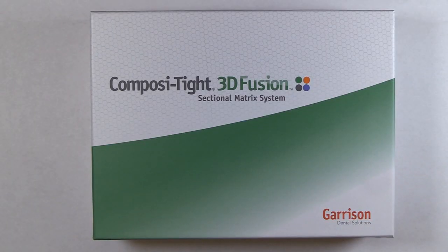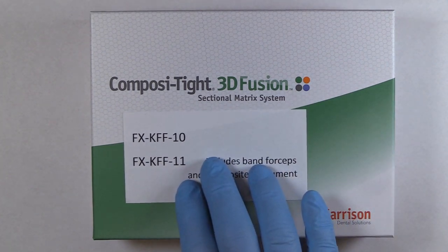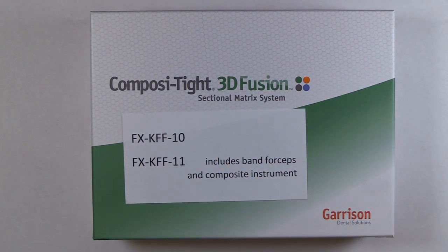This is what the actual kit looks like when you order it — it comes in this green box. The kit we're looking at is the KFF11, which has the band placement forceps and the composite instrument in it. There are other kits available. The very popular one is this exact same kit minus the band forceps and composite instruments. I wanted to make sure those part numbers were on the screen so you knew what to look for.